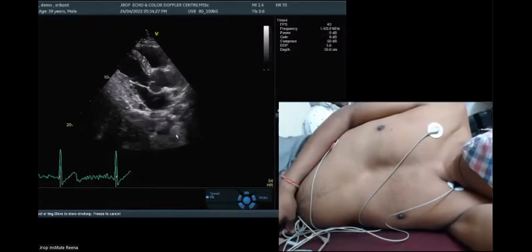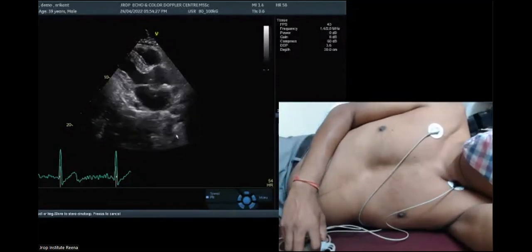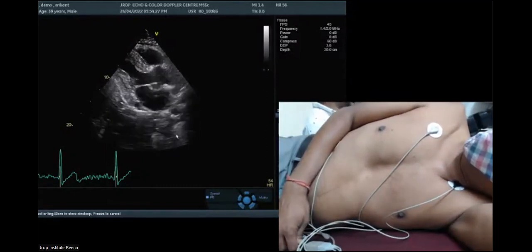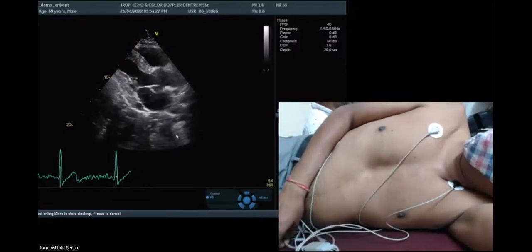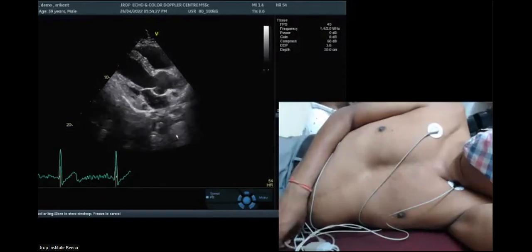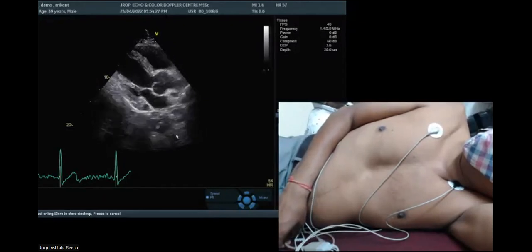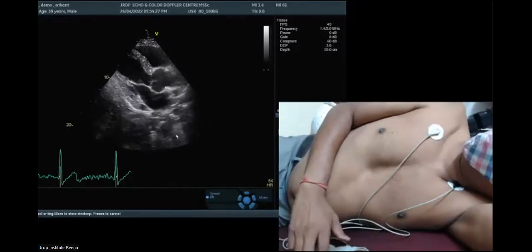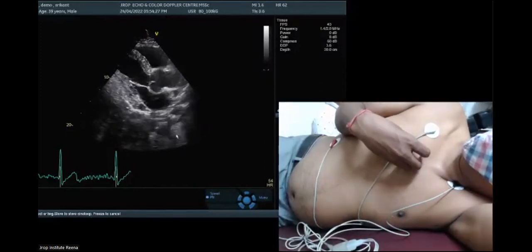But in cases of dextrocardia, they say that to look for that, you should first do the subcostal view and then start with the echo. If you know that we are going to scan dextrocardia, we will start from a subcostal view. And the patient would then be lying on the bed, facing towards yourself. Yes. Okay, sir. Thank you, sir.